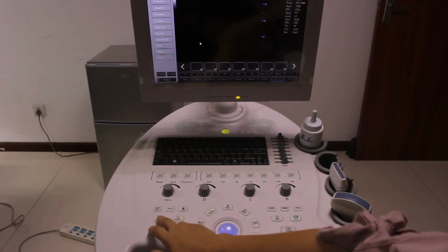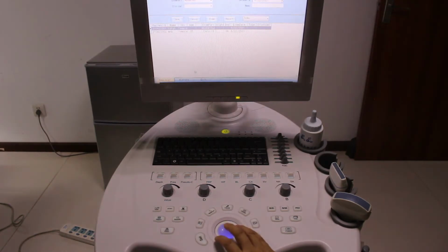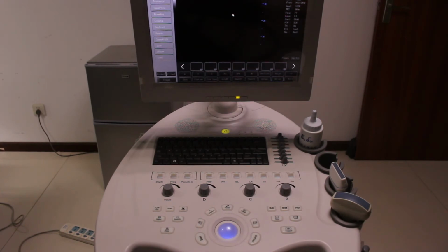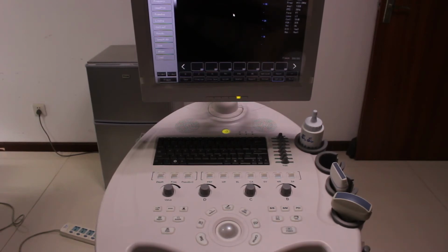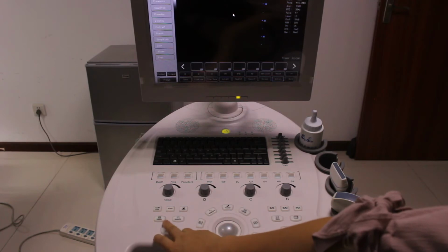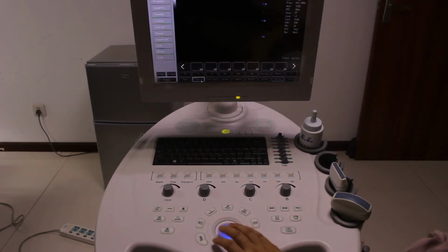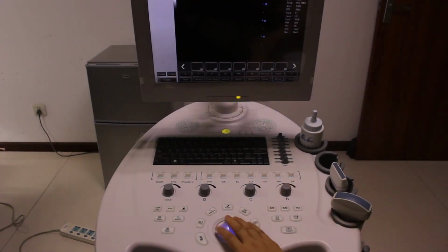Also, we can report disease. When you first get this machine, then you press print or press report. You will enter to create the patient. But after you use this machine twice or several times, then you own this. When you press report, it enters into the report. You also have this way to create a new patient.